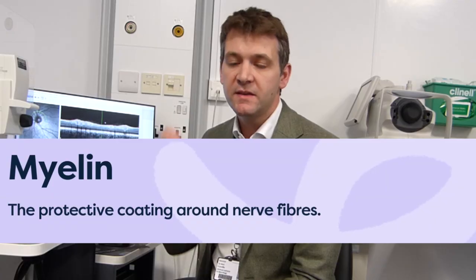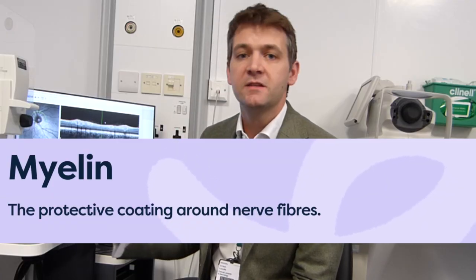Now, we shouldn't see any myelin in the eye itself, but we can see the nerves that are going to send their nerve fibers, their wires, back towards the brain. It's those nerve fibers that are going to lose their myelin, and we can then measure the loss of nerve fibers as a consequence of that in the eye. So essentially what we see is fewer nerve fibers, or thinning, in the back of the eye. And that's one of the reasons why OCT is so helpful.